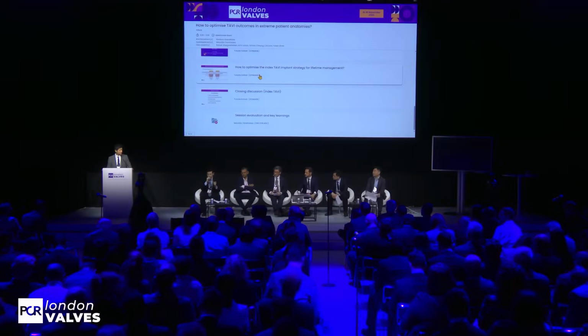Thank you, Kentaro, and great presentation, Yusuke. Actually, as he emphasized, I think the appropriate depth of the index procedure is very crucial for coronary access, of course, and for future redo TAVI. If the hemodynamics are not compromised, I always try to go slightly deeper, but still without causing a conduction disturbance. Of course, it depends on the patient's age and the underlying conduction disturbance, and so on. But as Yusuke emphasized in this study, nowadays we don't go too high, too shallow, in implantation, considering future redo TAVI.